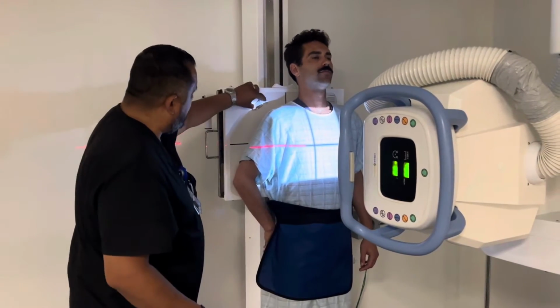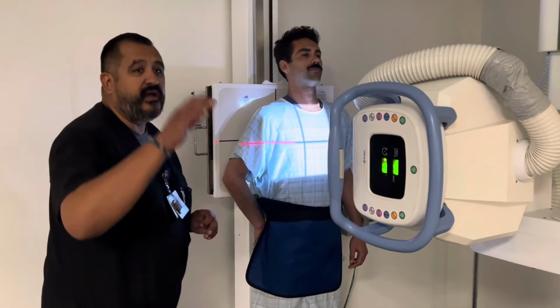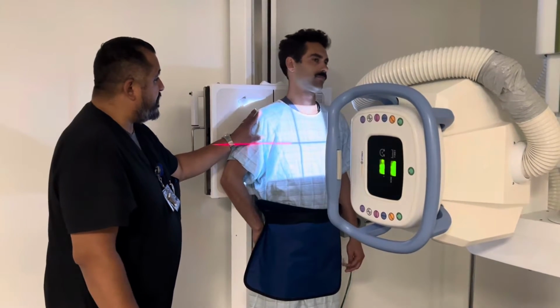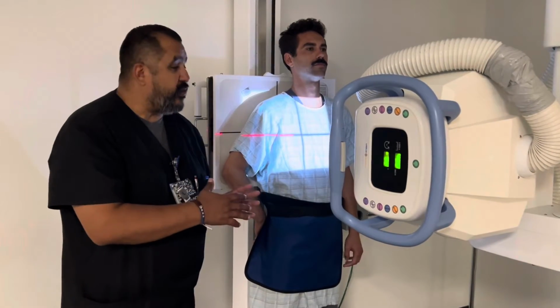Stay just like that. All right, so I'm going to move the marker up just a little bit. Stay just like that. Don't move. I go ahead and shoot that X-ray. Beep. All right, you go ahead and breathe and relax. All right, so now we just did an AP, right unilateral. So now we're going to do an oblique.